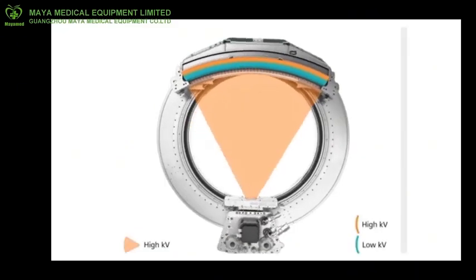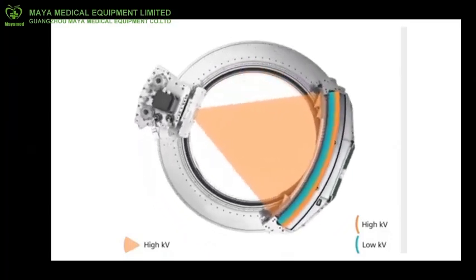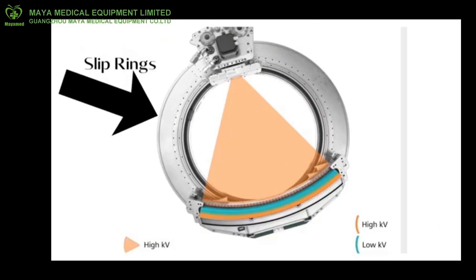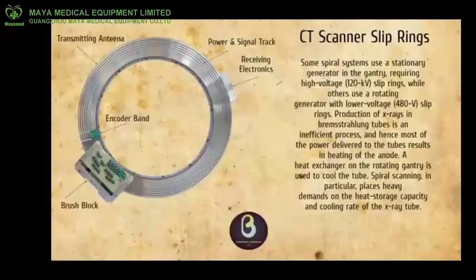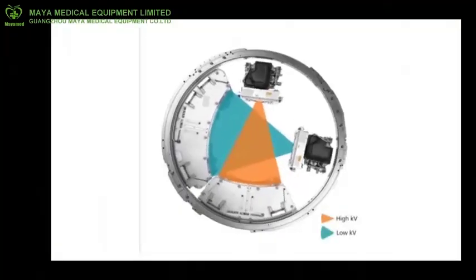The second component is slip rings. Old model design CT scanners used recoiling system cables to rotate the gantry frame. This design limited the scan method to the step-and-shoot mode and considerably limited the gantry rotation times. Newer systems use electromechanical devices called slip rings. Slip rings use a brush-like apparatus to provide continuous electrical power and electronic communication across a rotating surface. They permit the gantry frame to rotate continuously, eliminating the need to straighten twisted system cables, making helical scan modes possible.